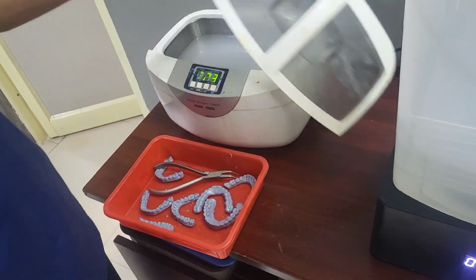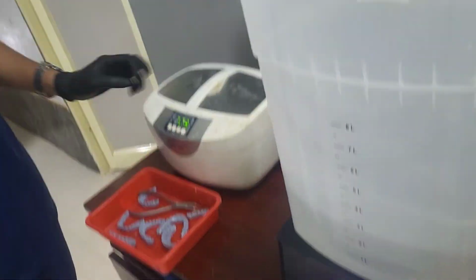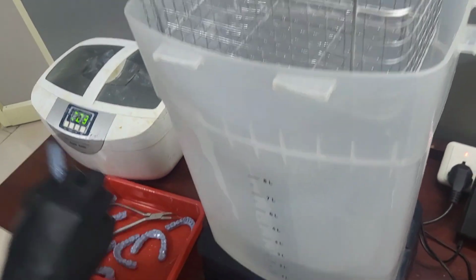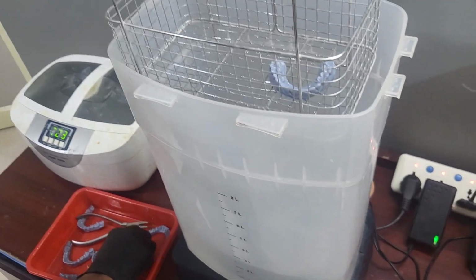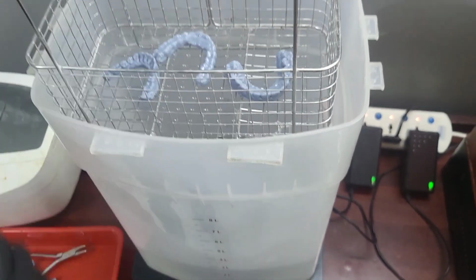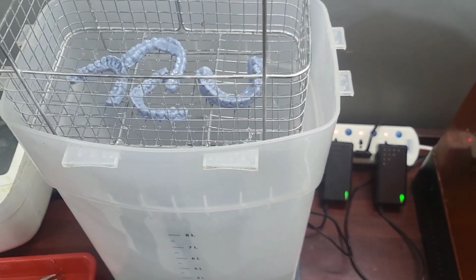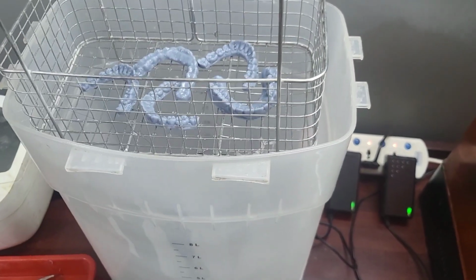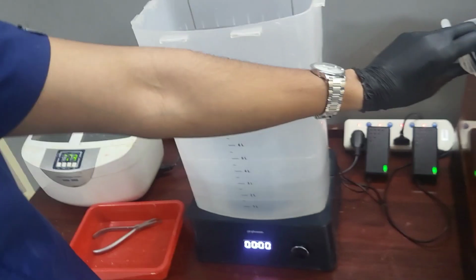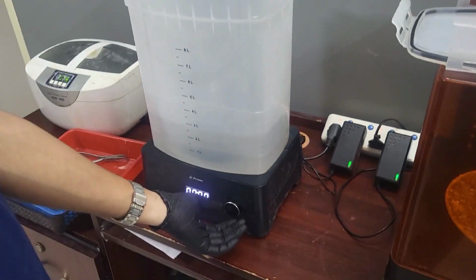All the models are retrieved from the ultrasonic cleanser, and the next procedure is the ultrasonic cleanser with isopropyl alcohol. All the models are placed in this again, and this process eliminates the residual soft resins and hardens the surface of the printed models. After immersing into the isopropyl alcohol, we close the chamber and set the timing.